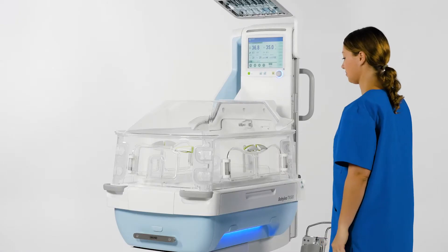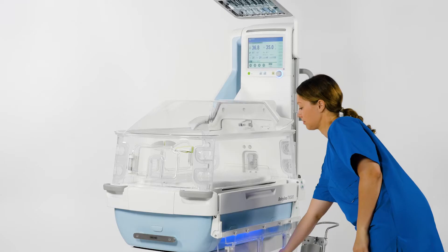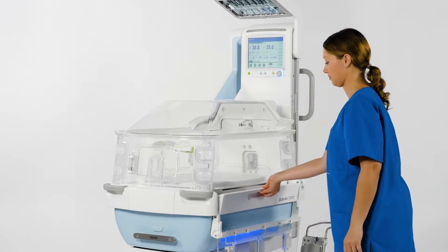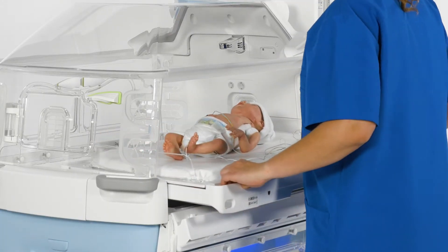When necessary, the bed support can be easily pulled out of the device from both sides, to remove the patient for kangarooing, for example. Open one of the two side access panels, then the X-ray flap. Then gently pull out the bed support using the recessed grips.